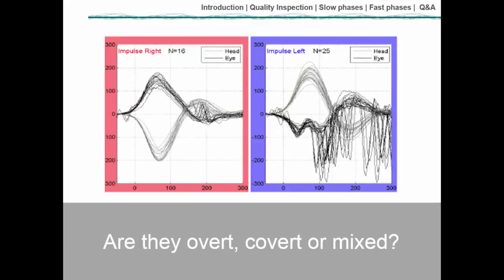Finally, identify whether saccades are overt — occurring after the head movement — or covert — occurring during the head movement. This distinction is useful for physical therapists and vestibular rehabilitation specialists to assess how well the patient is compensating over time, as there is interesting research on how the VOR restores itself and what happens to overt and covert saccades.